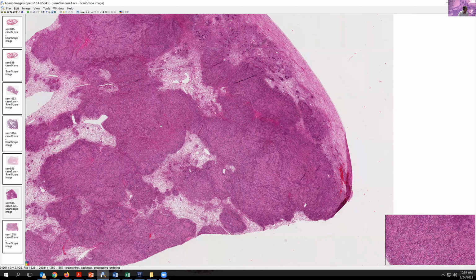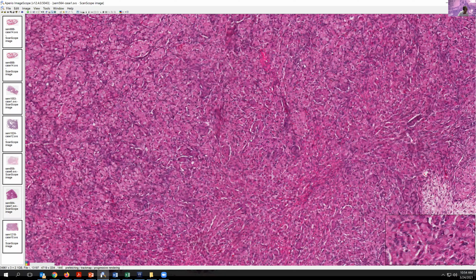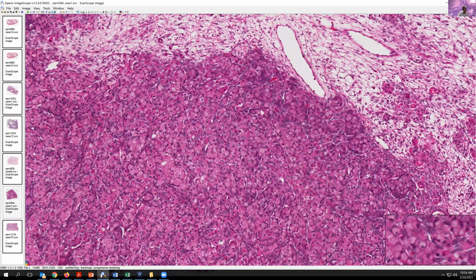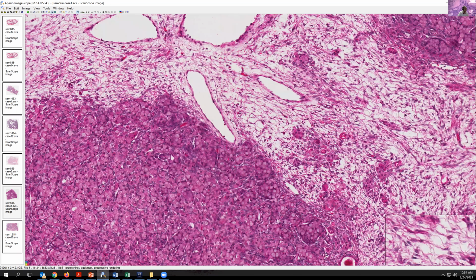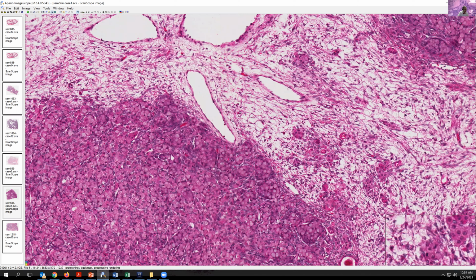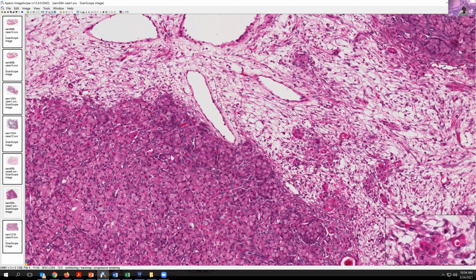And that's particularly a challenge because sometimes the stromal cells can become quite hormonally active. And so sometimes you'll be looking through the stroma in areas like this and you'll see clearly luteinized cells like these that might look very luteinized and even have features suggestive of crystalloids.